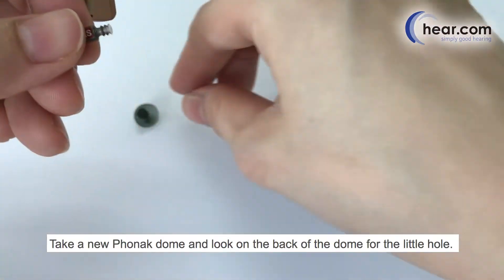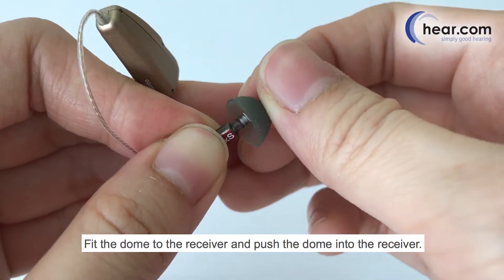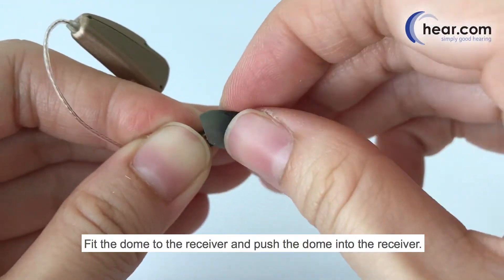Take a new Phonak dome and look on the back of the dome for the little hole. Fit the dome to the receiver and push the dome into the receiver.